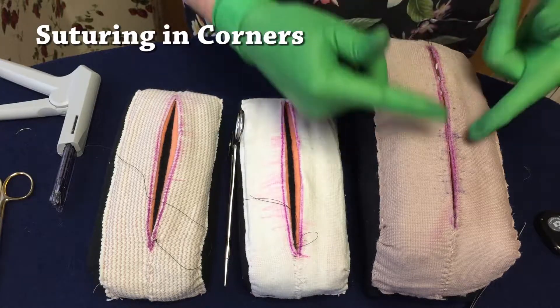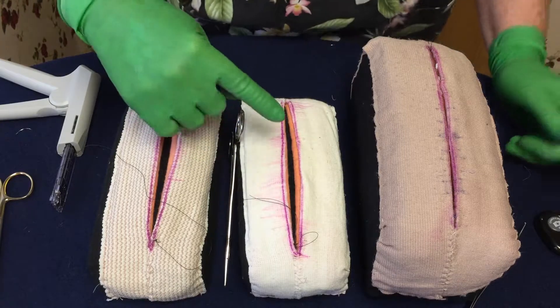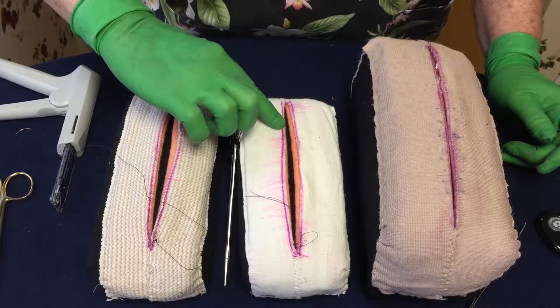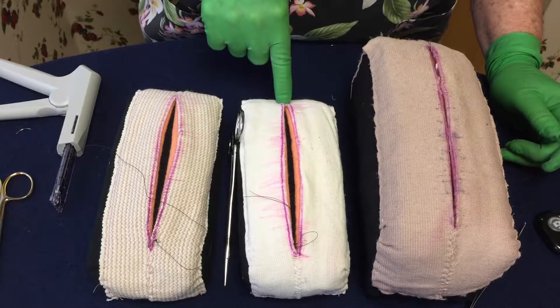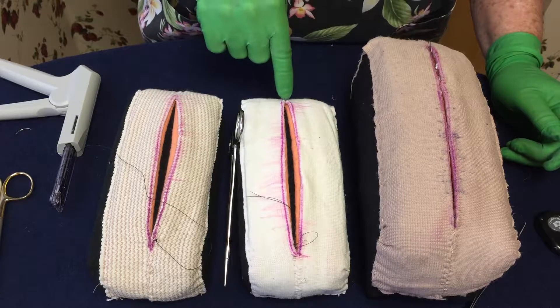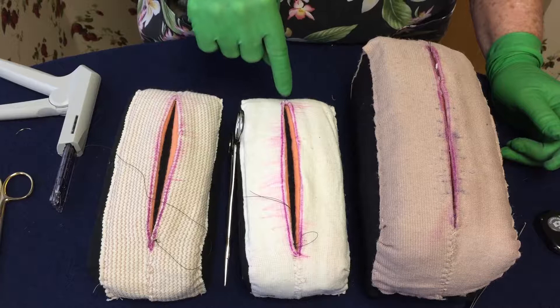I have a motto that I don't suture myself into the corner. If I was suturing, I'd suture down along here until I got maybe to about here. But I wouldn't suture myself all the way down — so my last stitch I take is here. I would suture here, and then I'd stop, take another, then I'd do my corner stitch here, and then I'd either work or fill in with it.